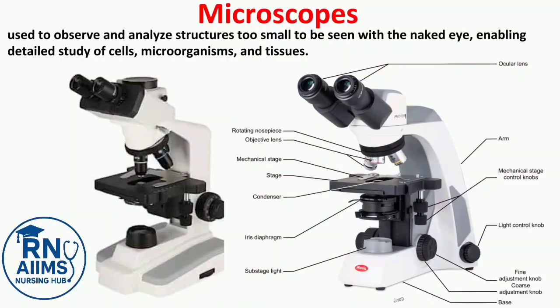Microscopes. Used to observe and analyze structures too small to be seen with the naked eye, enabling detailed study of cells, microorganisms, and tissues.